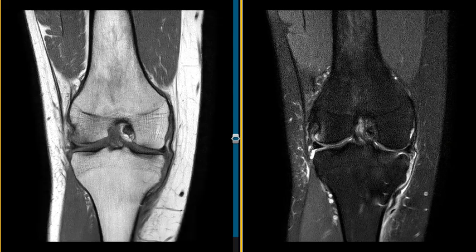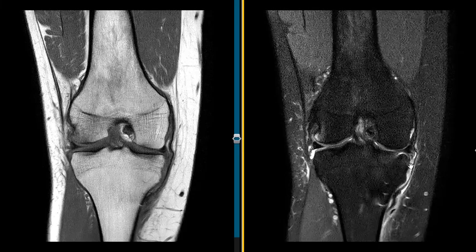And in this view, we see the problem along the medial side. We have the medial collateral ligament, which is this dark band. It comes down, it's pretty straight here, looking normal near the femoral attachment, but as it gets to the joint, it becomes lax. And over here, we see this band of intermediate signal between the bone and the medial collateral ligament.